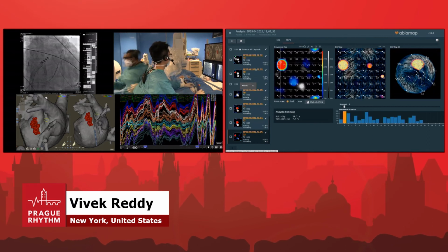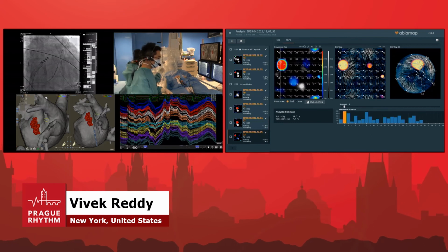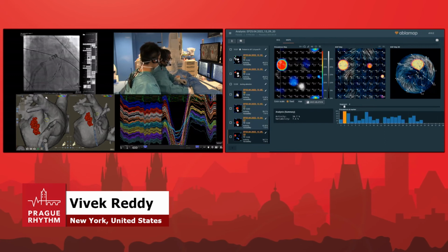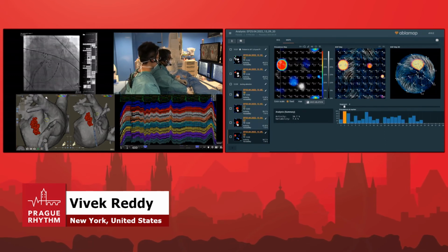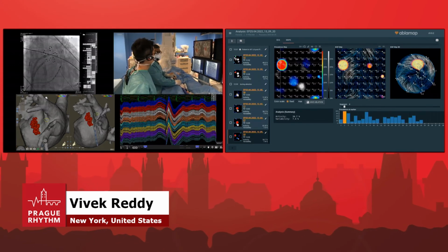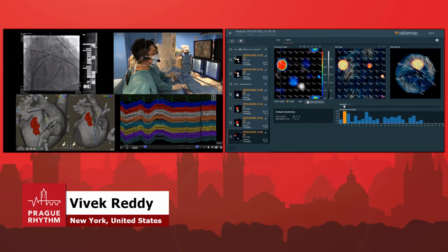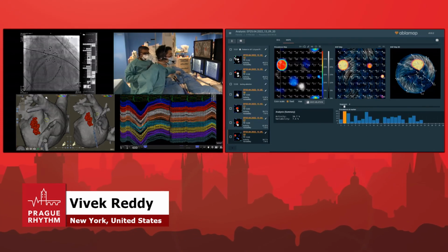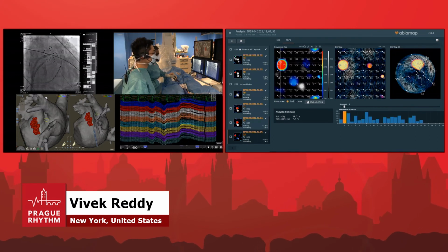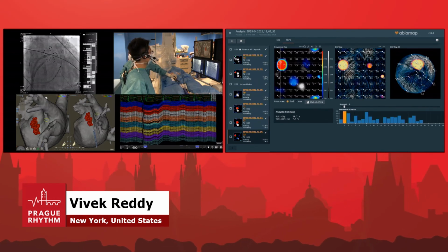Is it rotational or is it a hotspot? It's more focal. It looks more focal, Hiroshi. Focal means you're expecting an epicardial rotation activity, endocardial breakthrough, or a focal firing. Maybe, yes, we still need to figure that out. Can we see it? Oh, there. Yeah, and look, the reality is we don't know. It could be either. All we know is it's a focal mechanism that's emanating from that location.